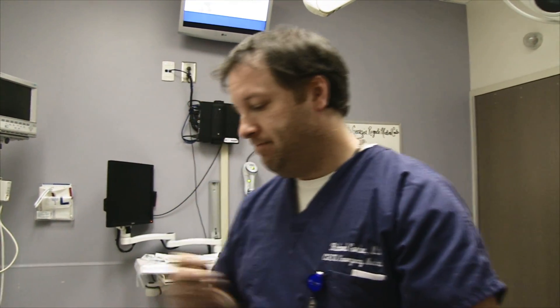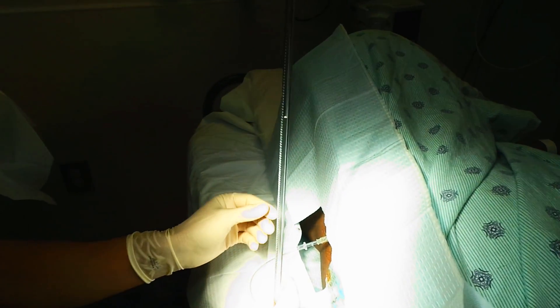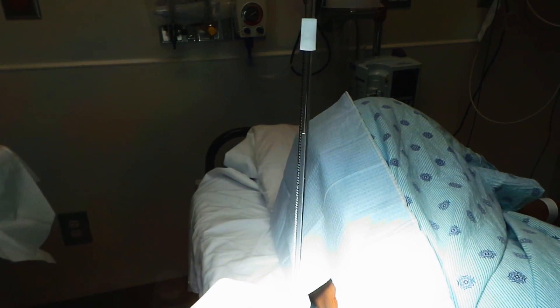This patient needs further evaluation for a reason as to why she has elevated intracranial pressure. Would we do the other eye or just one eye? You would normally do both eyes. In her case, she has a kind of anatomical variant where her optic nerve is serpiginous in appearance, so it's really hard to measure — so we can only do one side. We'll have her extend her legs out here in a minute.